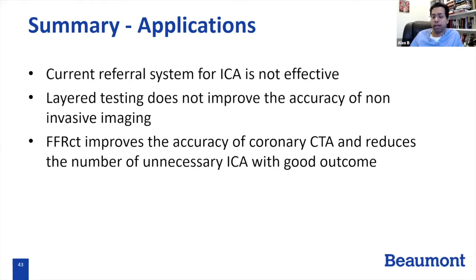And then in terms of AFib, for 10 years I have told our techs to send AFib home, but could you talk a little bit about that? Now that you're getting good results in AFib, you have the technologists reconstruct. Your range on the TeraRecon was 250 to 500 milliseconds. How do you decide, or is there just a number that you pick to reconstruct? That's the number we came up with for our protocol, 250 to 450. This arrhythmia protocol means we scan after the R wave at 250 to 450.